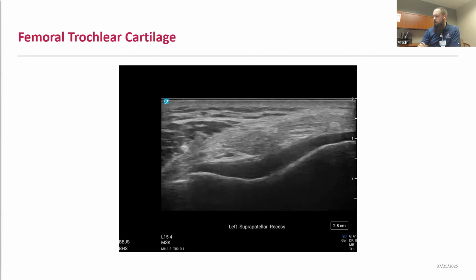At the anterior aspect of the knee, you can also assess the hyaline cartilage, both of the femoral trochlea, as well as more anteriorly in the parasagittal plane, you can look at the hyaline cartilage of the femoral condyles. And so here is a short axis view of that femoral trochlear cartilage. You can identify osteochondral defects in these areas. You can look for calcific deposition, such as with pseudogout or sometimes gout crystals on the chondral surface. And so these are various things that can be diagnosed and identified with diagnostic ultrasound.